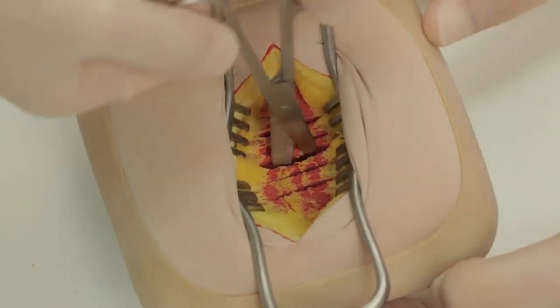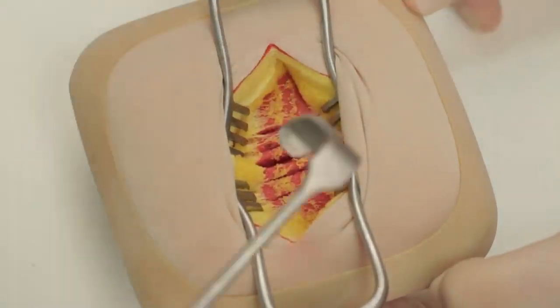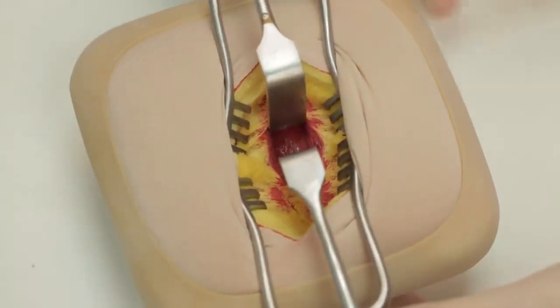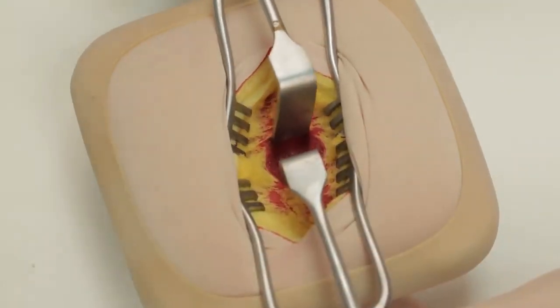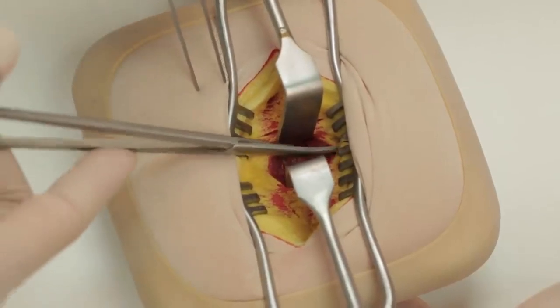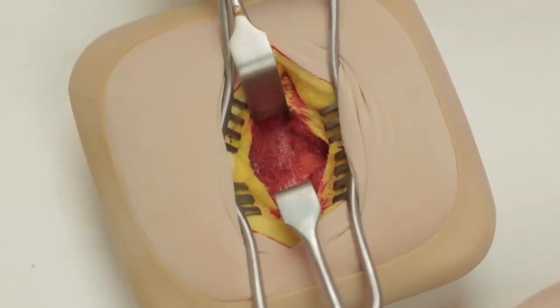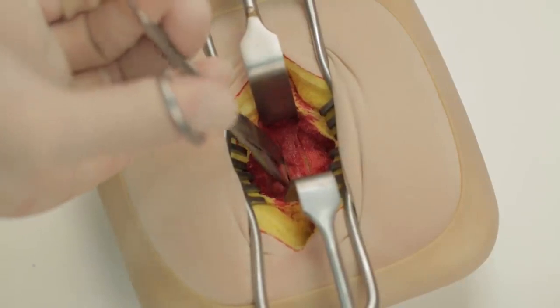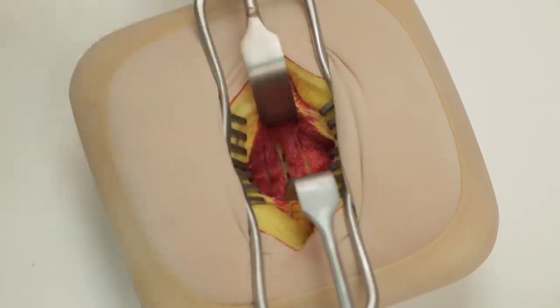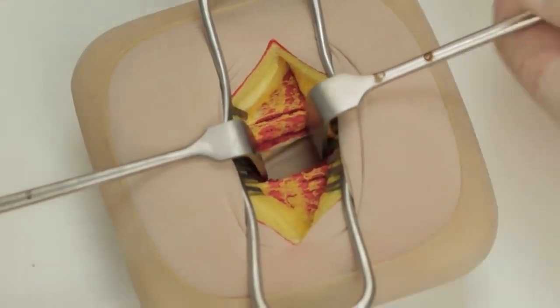We have purposefully scored this model to demonstrate the technique, although in the models with which you are presented, this will not be evident. The split can be widened using Langenbeck retractors to display the muscle underneath. Transversus abdominis should also be split in the line of its fibres. Beneath this muscle, the fused transversalis fascia and peritoneum will be visible.